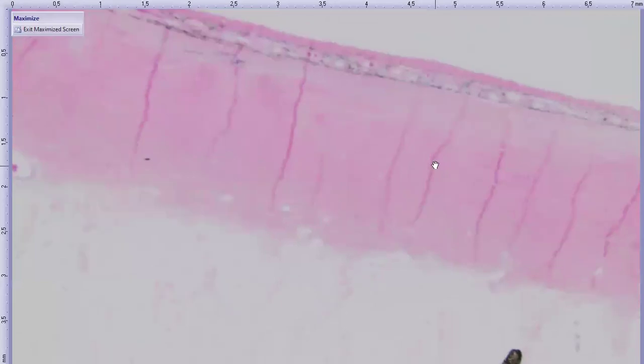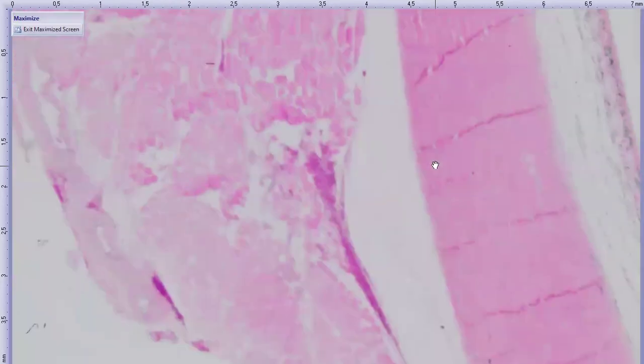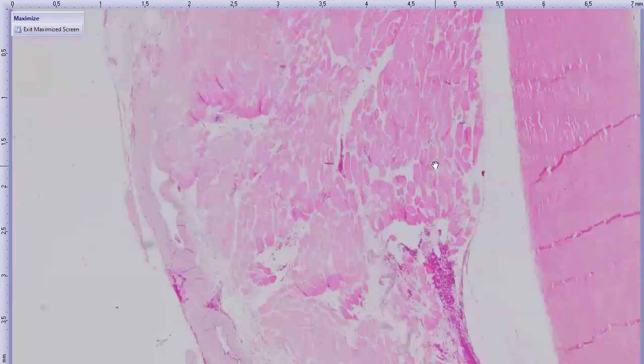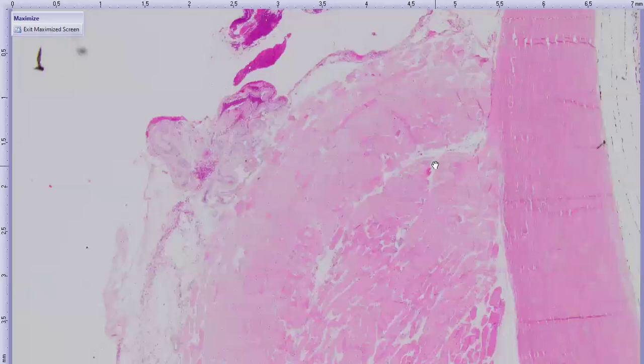So this tumor has been published as a case series of about 6 cases. As such, I would say that its biologic behavior may be kind of up in the air. We don't have a whole lot of cases to characterize how it's going to behave, but at least based on the follow-up that they have for very limited case numbers, it's a slow-growing tumor, and even incomplete excision may get you a pretty good clinical result.